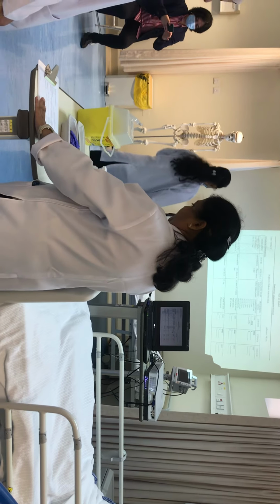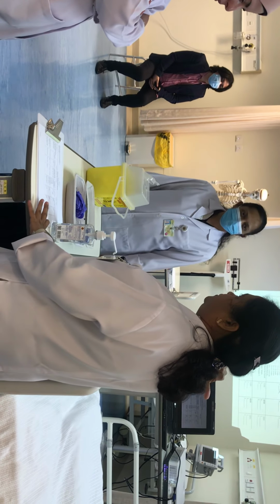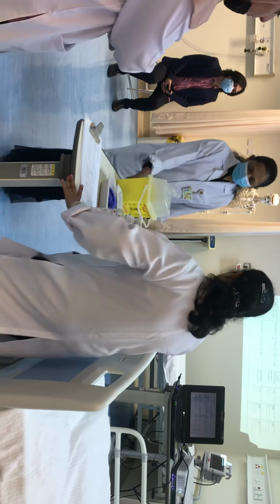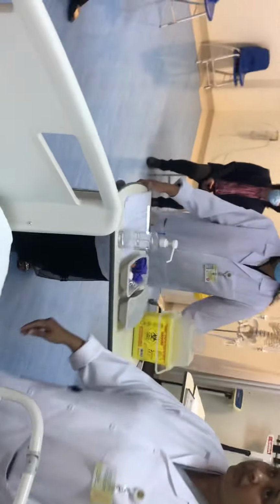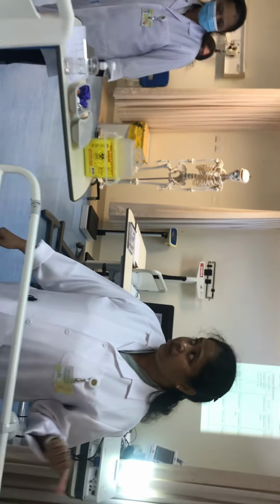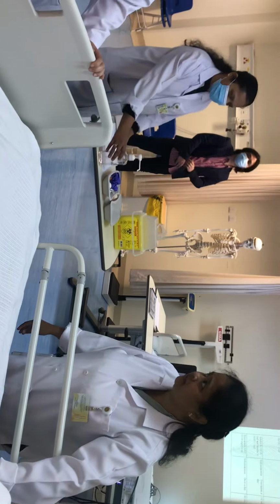Okay, so everything is there. Now I go to the bedside. Second, third check I will do there. Then I am going to give to the patient directly. The second syringe is also coming with me. So when I come back, I should remember to do the re-identification, because it is medication. A second time I am verifying my patient's identification.